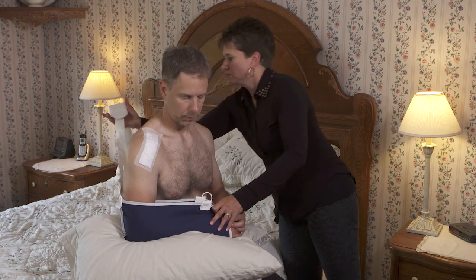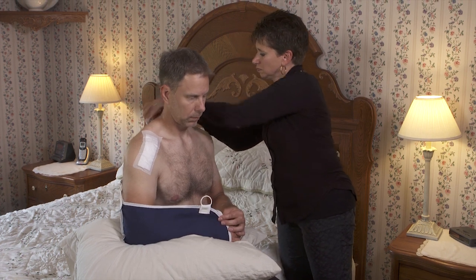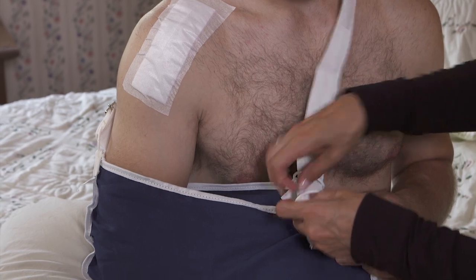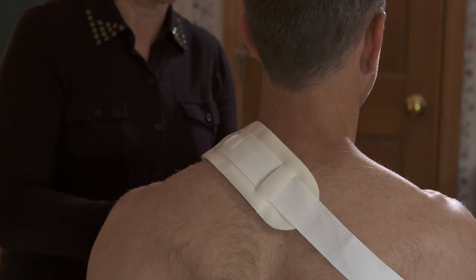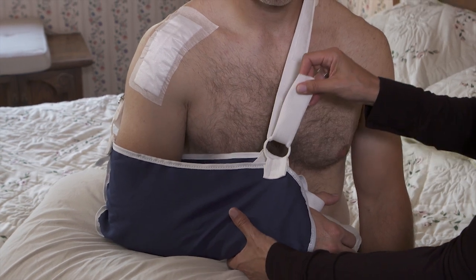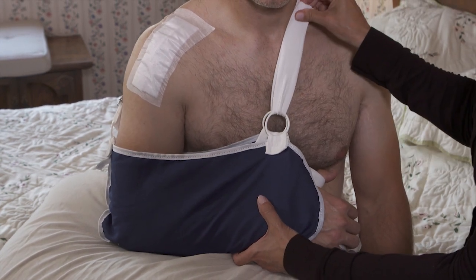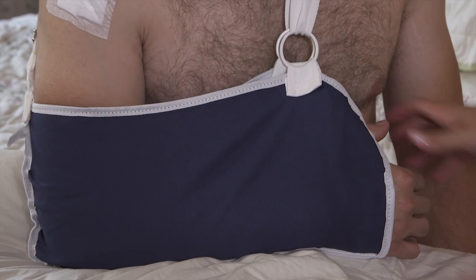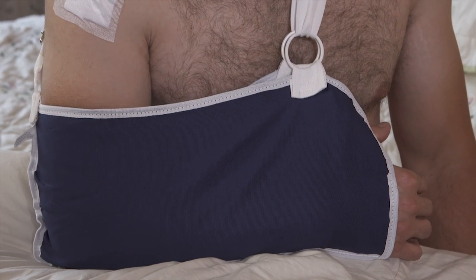Next, your helper brings the strap over the shoulder that is not healing and threads it through the 2 rings. The protective pad should be over your neck. Your helper puts a hand under your wrist to support your arm as he or she securely attaches the Velcro on the strap. Your arm should be bent slightly upwards.